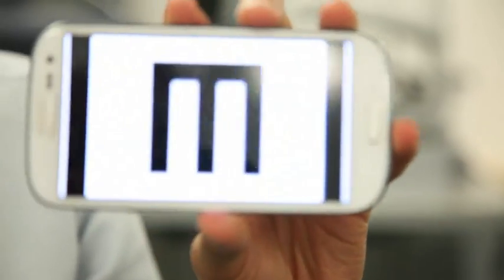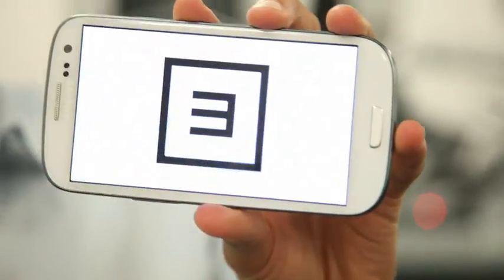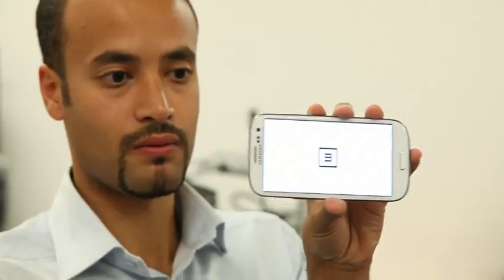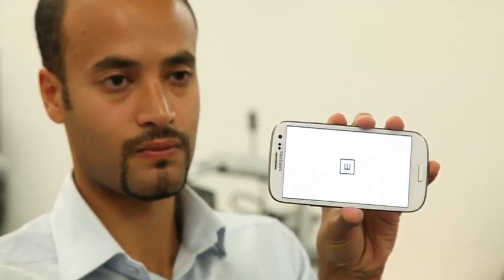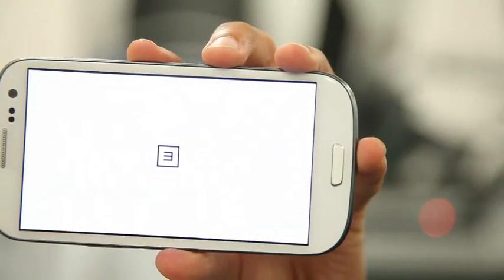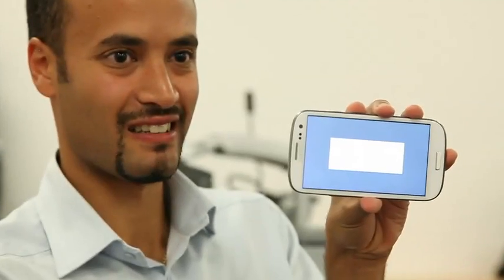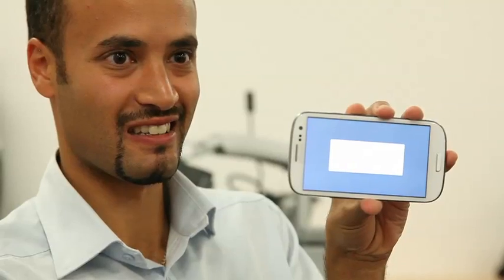So if you point to where you think the legs of the E point. Down. Down. So all I would do to record your answer is swipe down. To the left. Up. Down. Left. Down. Right. Yes. There you go. Oh, finished. That was a lot quicker than going to the optician.